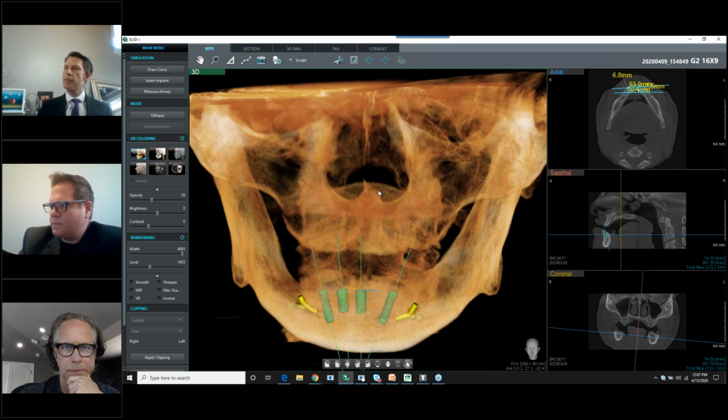Dr. Engel, how long does that usually take for you when you do these cases? You know, a couple days, it really depends. What is an average timeline for that? Typically they'll do a GoToWebinar and design the case with you within 2 or 3 days. The average is 3 to 4 working days. Sometimes I have a case where someone's coming in from out of town. You can pay a little rush fee and get it in a day and a half. Gotcha.